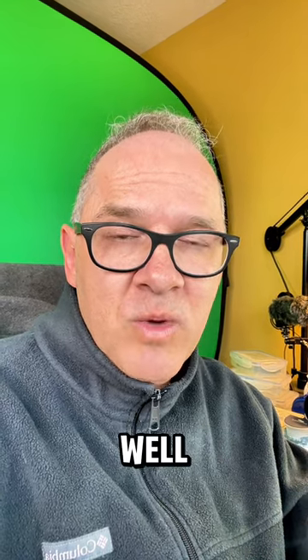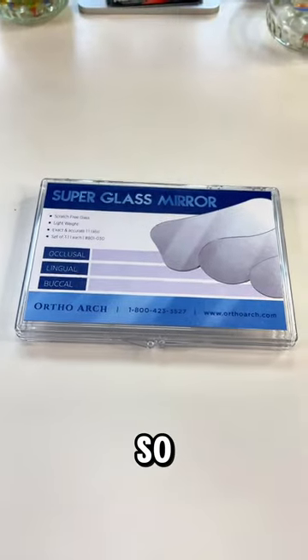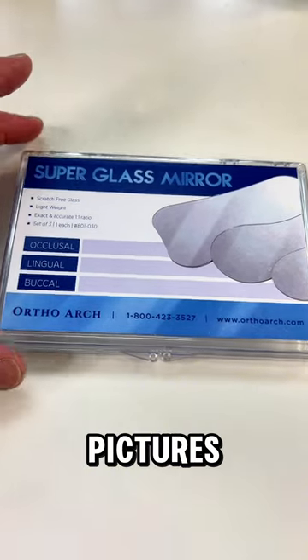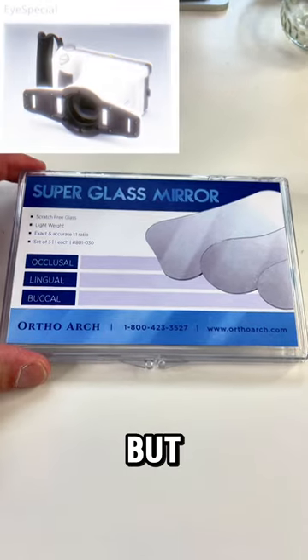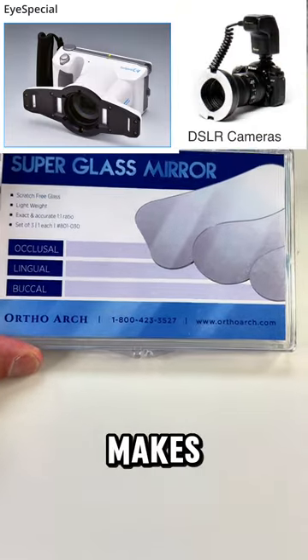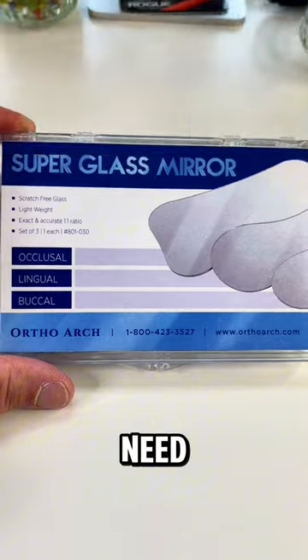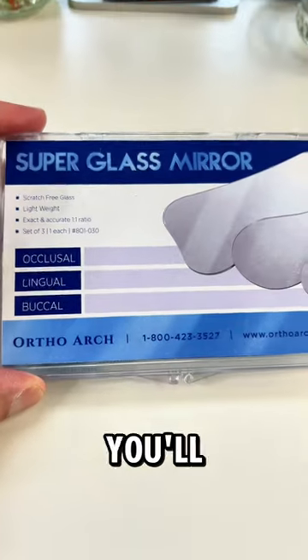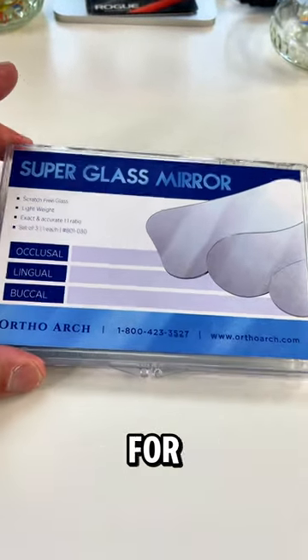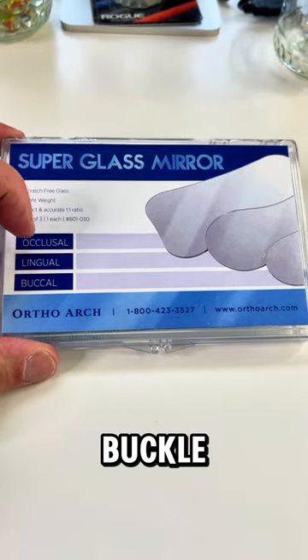Let's go through these instruments that you would need for basically treating patients as well as practicing and doing the typodont exercises. First, you're going to need to be taking some pictures — intro pictures. You will need a camera with a ring flash. The Shofu camera is a point-and-shoot option, but any camera that has a ring flash would work. You will also need mirrors: an occlusal mirror as well as a buccal mirror for taking intro pictures and records.